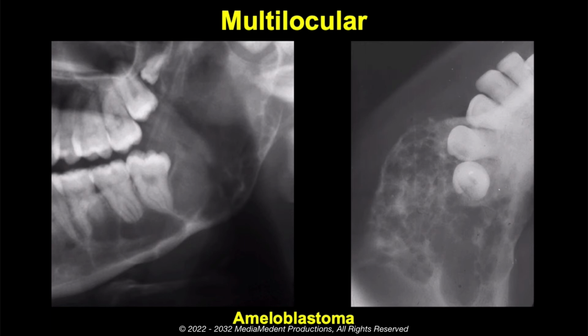By consideration of the patient's age, sex, and race, the location of the lesion, association with tooth displacement and/or root resorption, and the radiographic appearance of the internal structure of the lesion, the clinician may rearrange this list to an order of frequency. The unicystic variant, also known as the mural ameloblastoma, may arise from the epithelial lining of a dentigerous cyst and is radiographically indistinguishable from the dentigerous cyst. You should keep in mind that malignant variants of the ameloblastoma do exist.